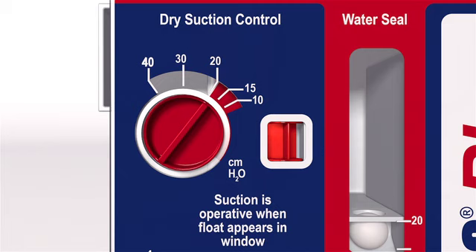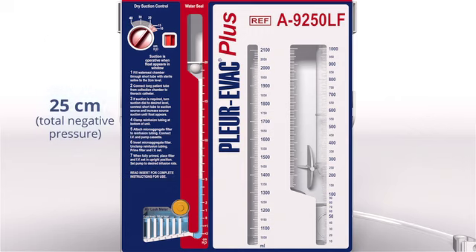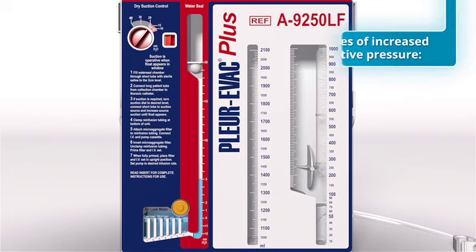Patient negativity can be determined by adding the level of imposed suction to the number corresponding with the water level in the water seal. For example, 20 cm of water dialed in the suction chamber is added to 5 cm of the height of water in the small arm of the water seal chamber. This equals 25 cm of water, or the total amount of negative pressure in the patient's chest cavity.